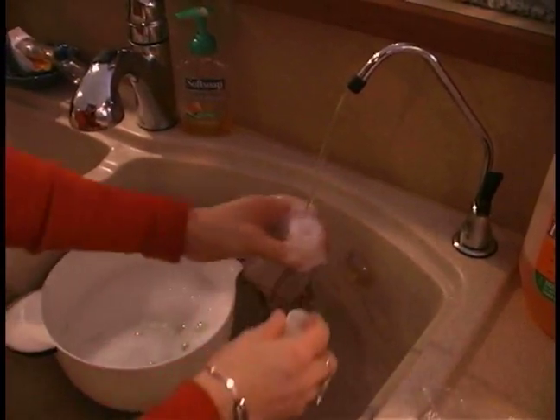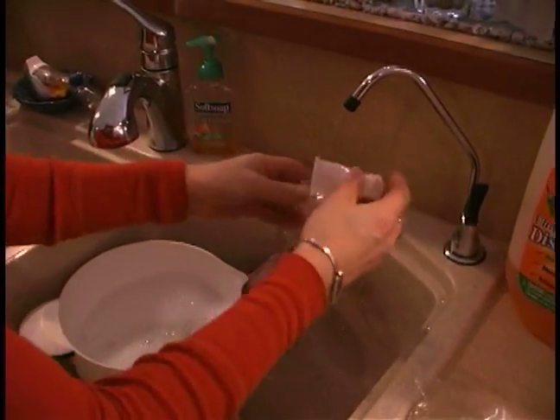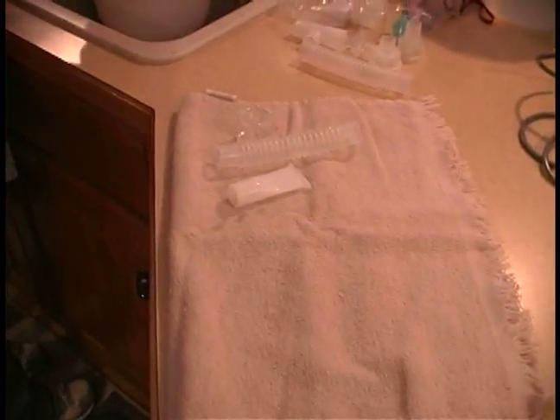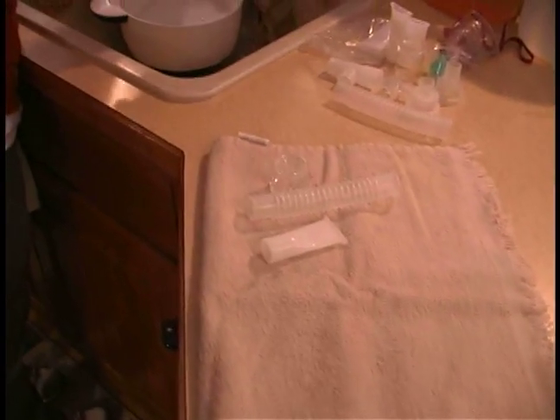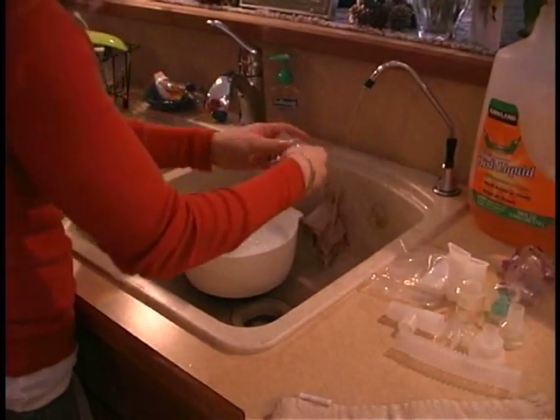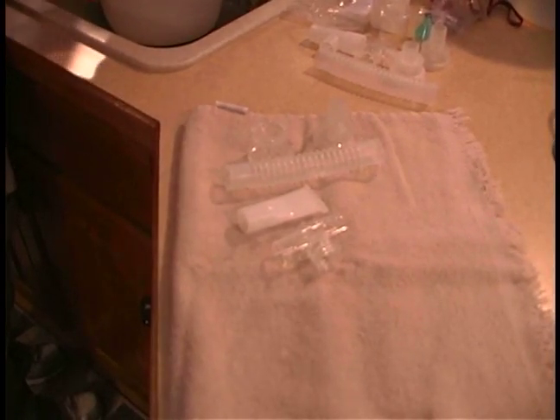Then we're going to take each part and make sure that it's thoroughly rinsed. We're going to set it out on an area to dry. You can use paper towels or a dish towel, but you want to make sure that it's a clean dish towel. Dish towels that have been used a few times can actually harbor quite a few germs and bacteria.